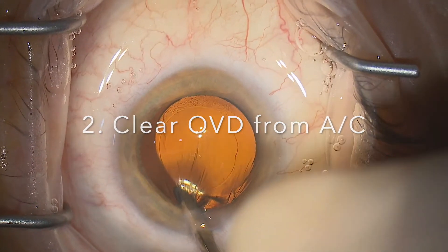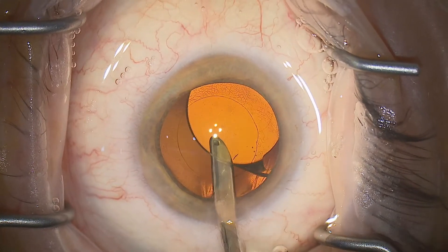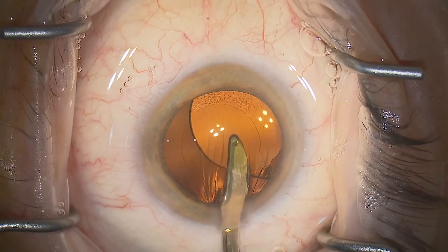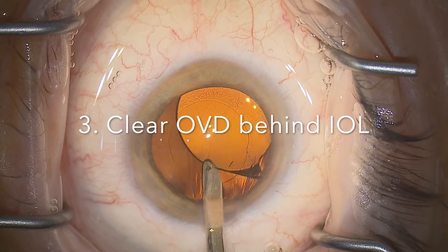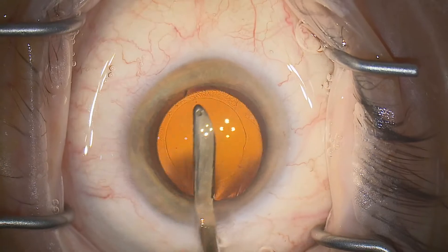Step two is a thorough clearance of the viscoelastic from the anterior chamber. That allows the lens to rise up anteriorly and assists in step three, which is a thorough clearance of the viscoelastic from behind the lens optic.